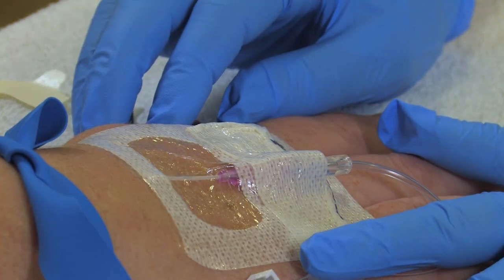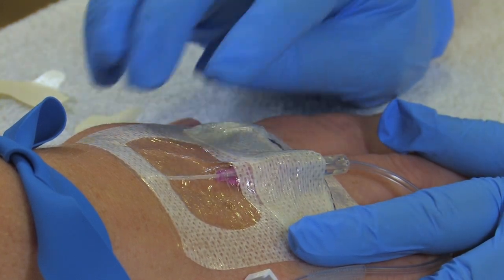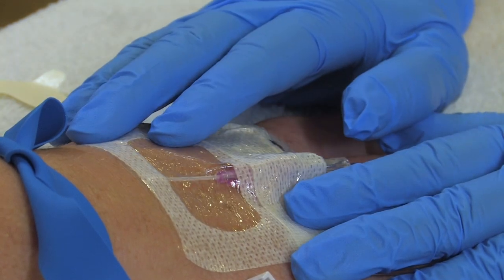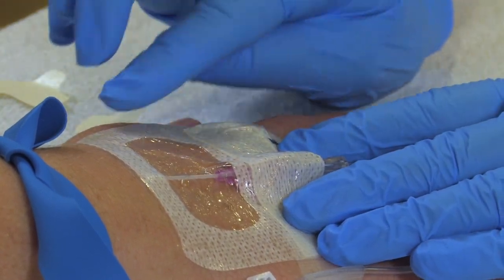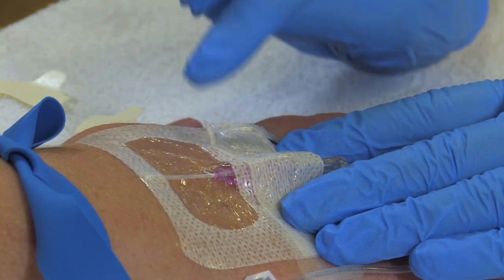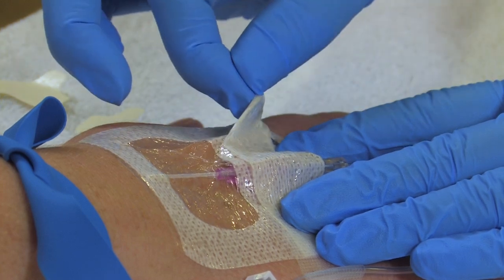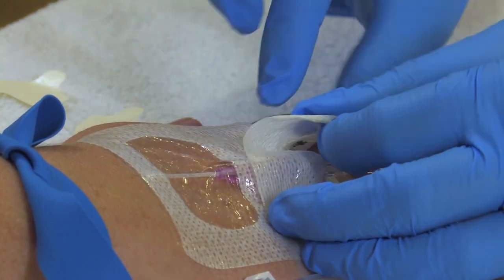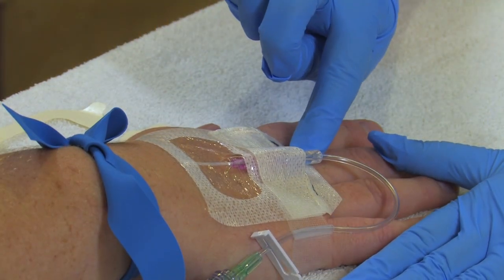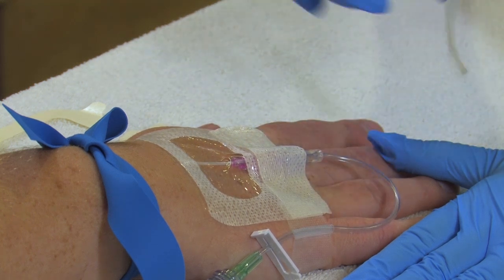So at Mission Hospital, our IVs can dwell for 7 days. You have to follow your hospital policy, but in the event that this needs to be changed because it's become soiled, 3M is very easily removed. All you have to do is roll the edge with your glove on, because it's going to help stick to the glove, till you get a corner, and then you can very easily remove it from itself. So we want to start with the last piece of tape we put on. So we'll roll till we catch an edge and remove it.